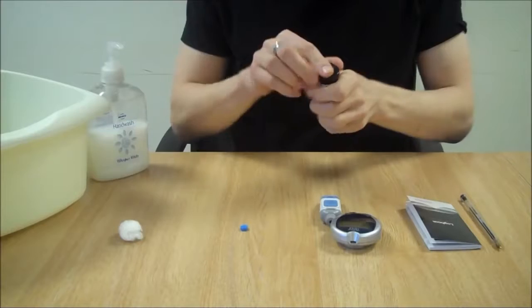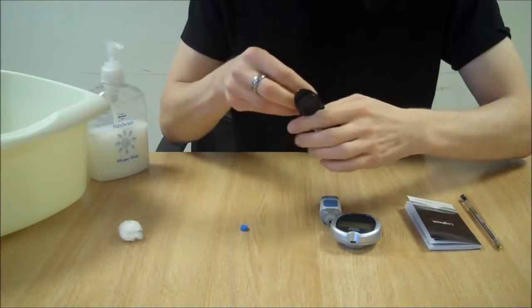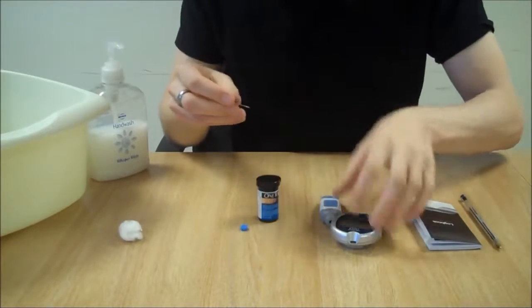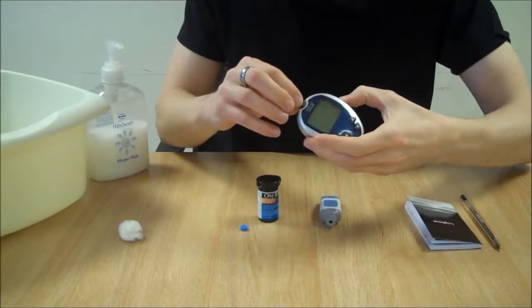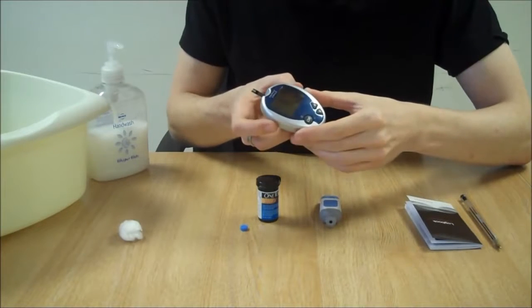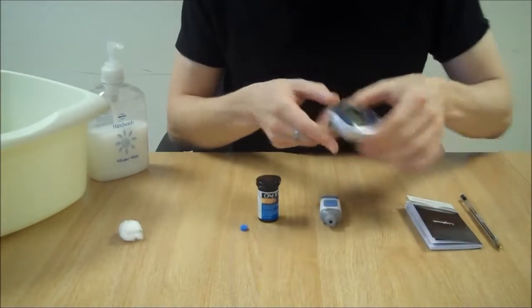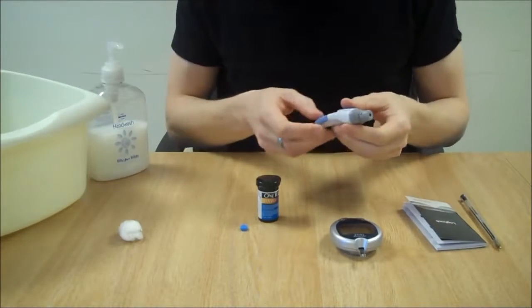Load a test strip into the blood glucose meter. This one switches on as you put the test strip in.